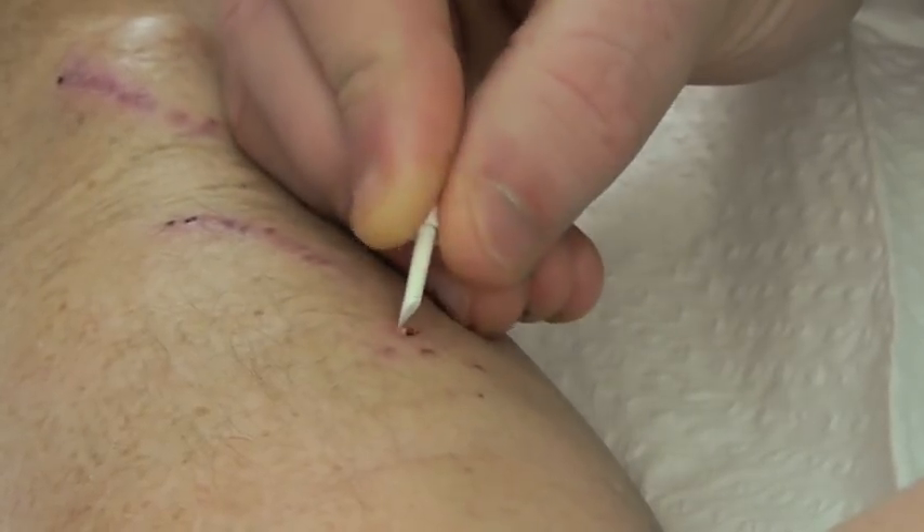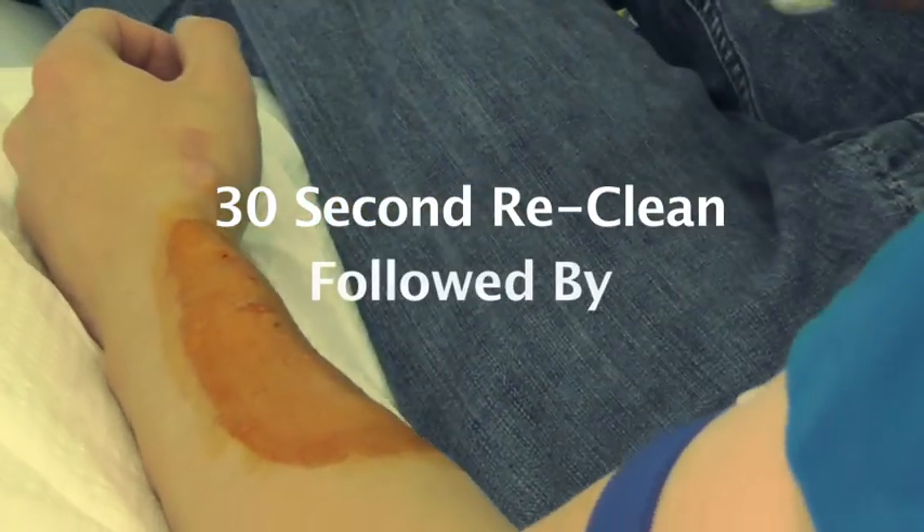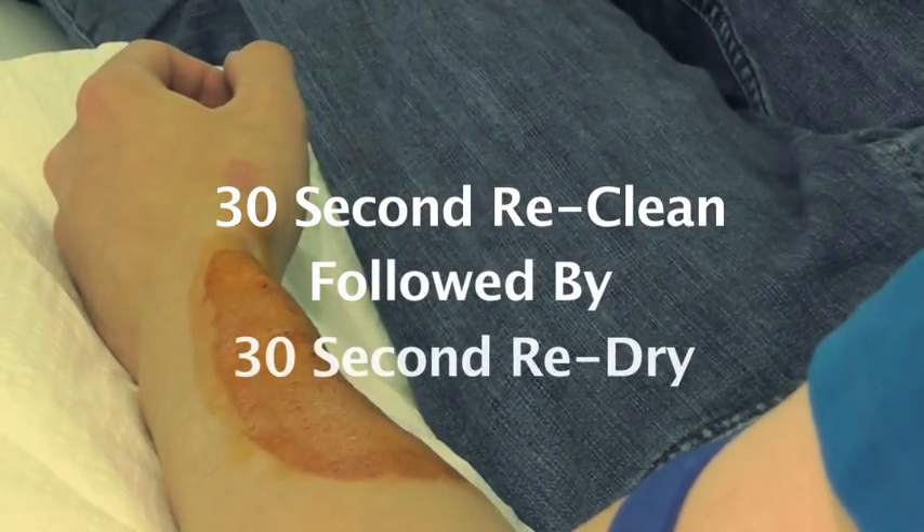When picking the scabs you should use a scraping method. Don't dig. After picking the scab off you should clean the fistula for 30 seconds and allow to dry for 30 seconds again.